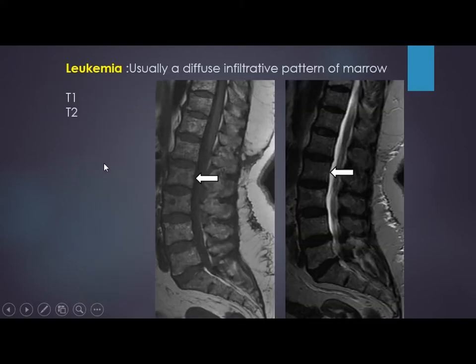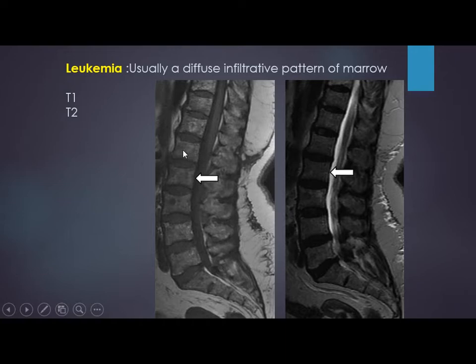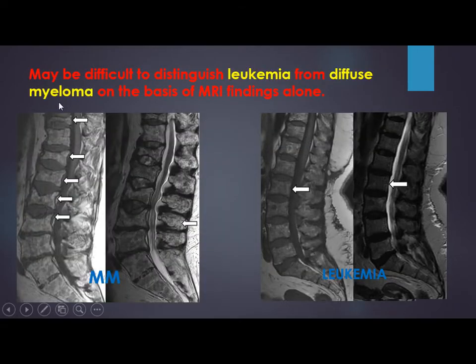Leukemia is one of the myeloproliferative disorders. Leukemia usually has a diffuse pattern, not multifocal or focal like multiple myeloma. On T1, the signal of the spine is less than the disc, so it is pathological — this is T2 in diffuse form. In this case, we cannot differentiate between leukemia and diffuse myeloma. To reach the diagnosis, other lab tests and history are important. The report would be suggestive of myeloproliferative disorder — for example, plasma cell disorder for myeloma, WBC for leukemia, or RBC for polycythemia rubra vera.